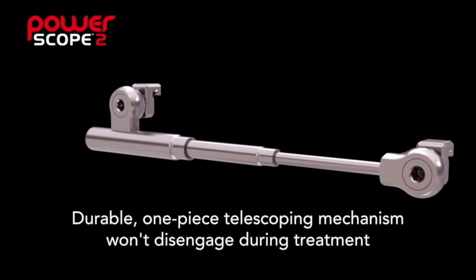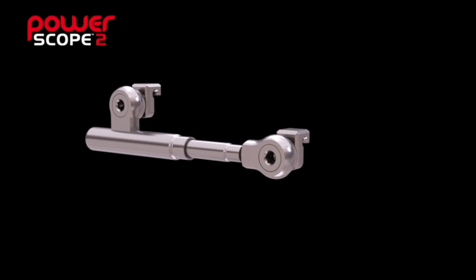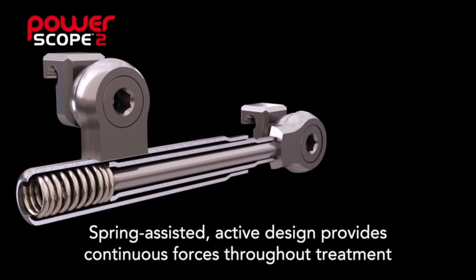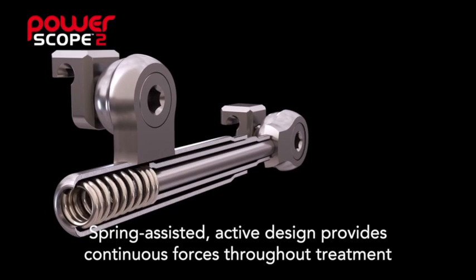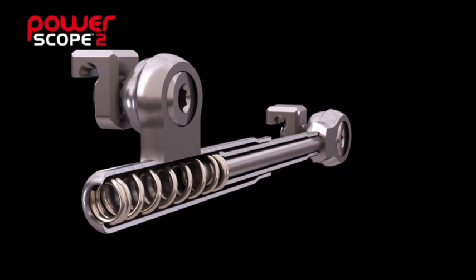PowerScope features a durable one-piece telescoping design that won't disengage during treatment, helping to reduce emergency visits. The appliance delivers continuous forces during treatment with the spring-assisted active design. This internal nitinol spring delivers 260 grams of force, which can mean reduced treatment time compared to other Class 2 appliances.